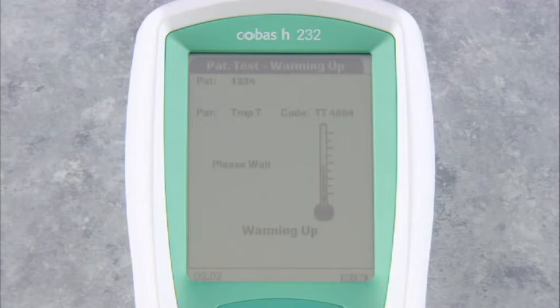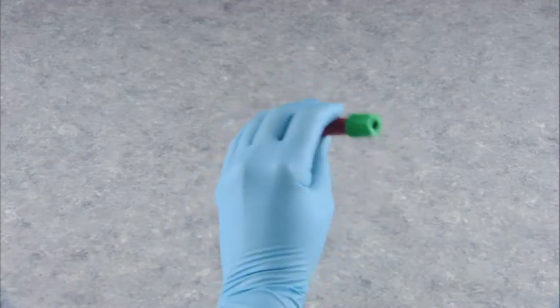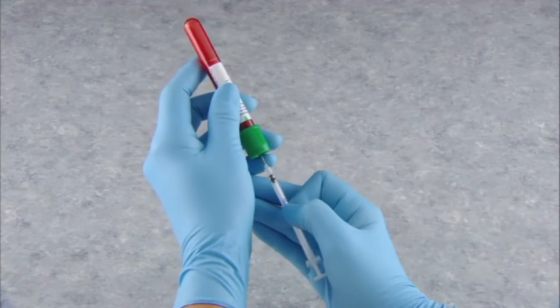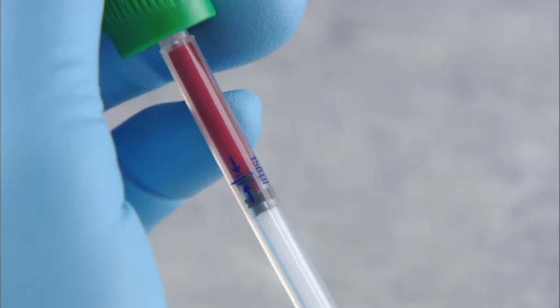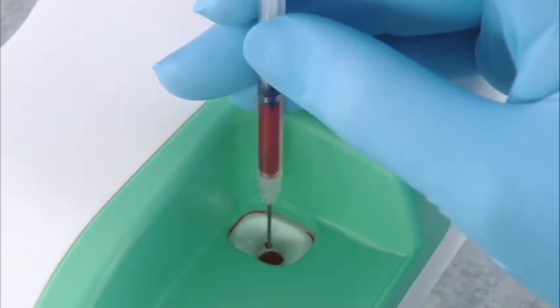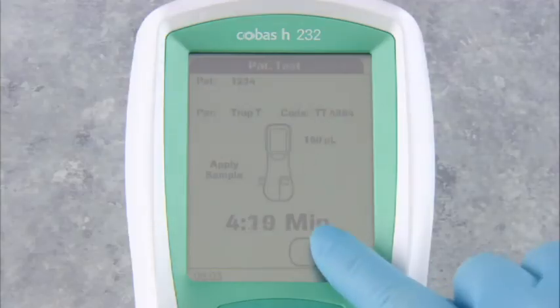The screen changes to patient test — warming up. After a few seconds, the screen changes to patient test — apply sample. You have five minutes to apply the sample. Gently invert the tube of blood about four to five times before withdrawing the sample. Using a Roche cardiac pipette, withdraw 150 microliters of venous blood from the heparinized vacutainer. Make sure that the top of the blood sample is located at the blue line between the two blue arrows on the pipette, and make sure the sample does not include any bubbles. Holding the pipette vertically over the sample application area, slowly apply the sample so as not to lose any of it. Dispose of the pipette according to your facility guidelines, then touch the check mark on the meter touch screen.